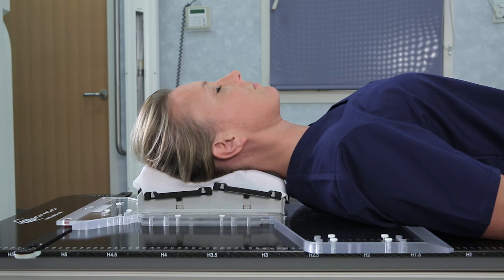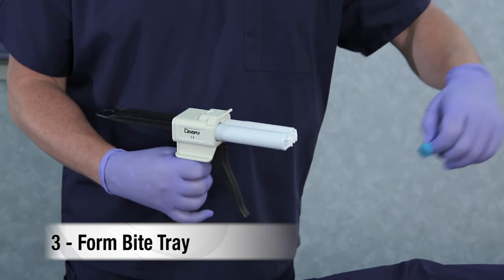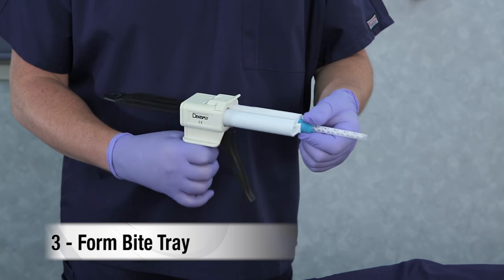Next, form the bite tray. Attach the putty to the putty dispenser. The superior notch on the bottom of the putty will align with the dispenser. Then, attach the dispensing straw to the putty.